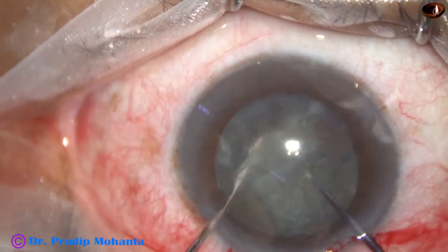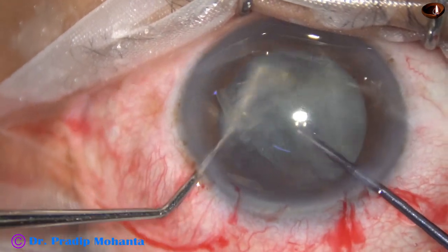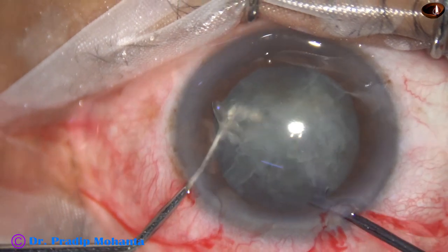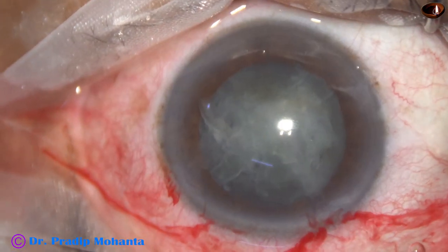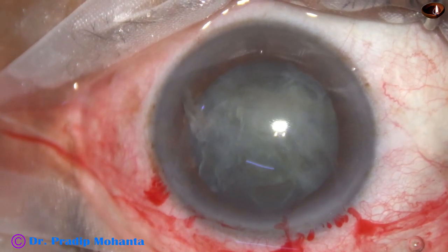Rotated. One heminucleus divided into two halves. Rotated again. The other heminucleus is divided into two fragments. Thus we have four fragments in a very short time.